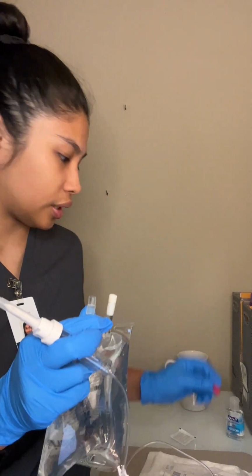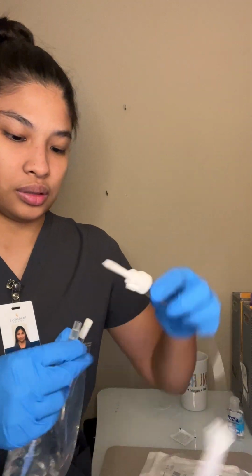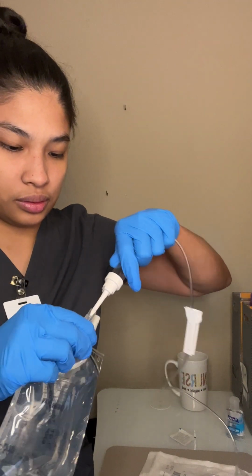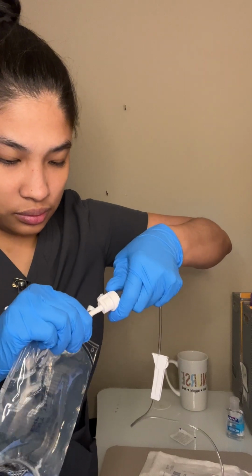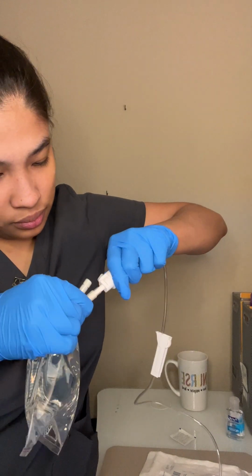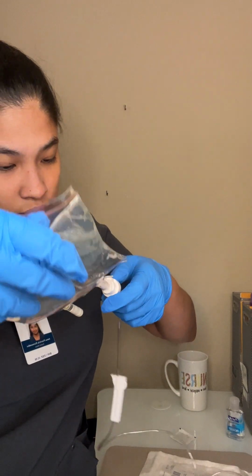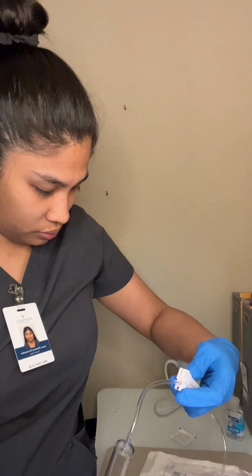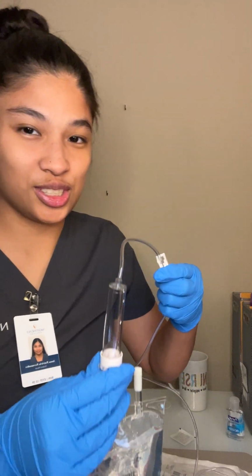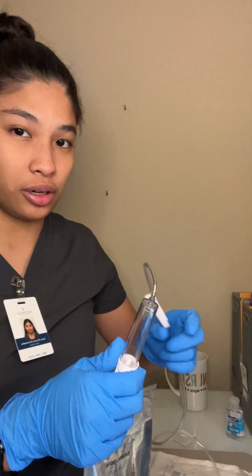So you want to take this off. Just checking, you want to make sure that the roller clamp is off, just so you won't be dripping all over the place.